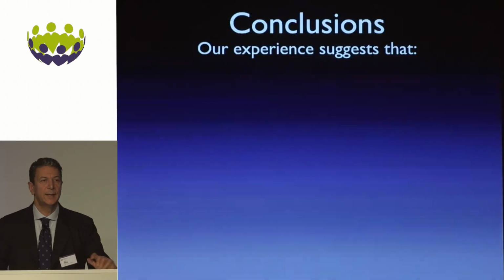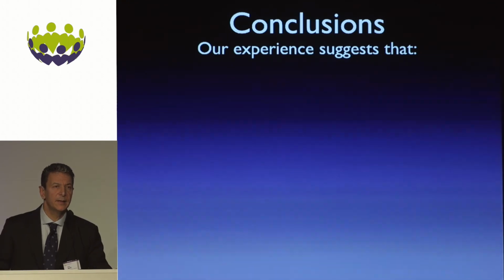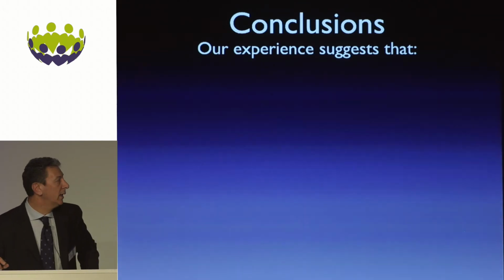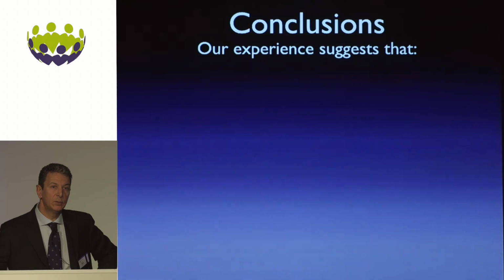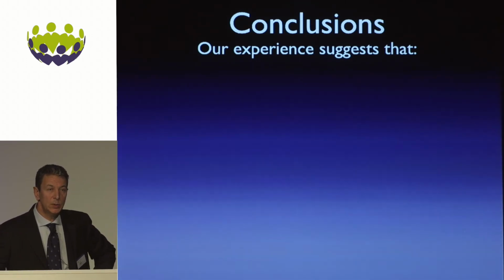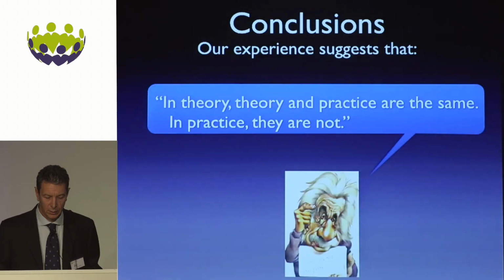My conclusion is that the ICE is a safe and effective alternative to the TEE. My presentation, as I said before, is propaedeutic to the next presentation by Eric, in which we will share a real case, from the theory to the practice.